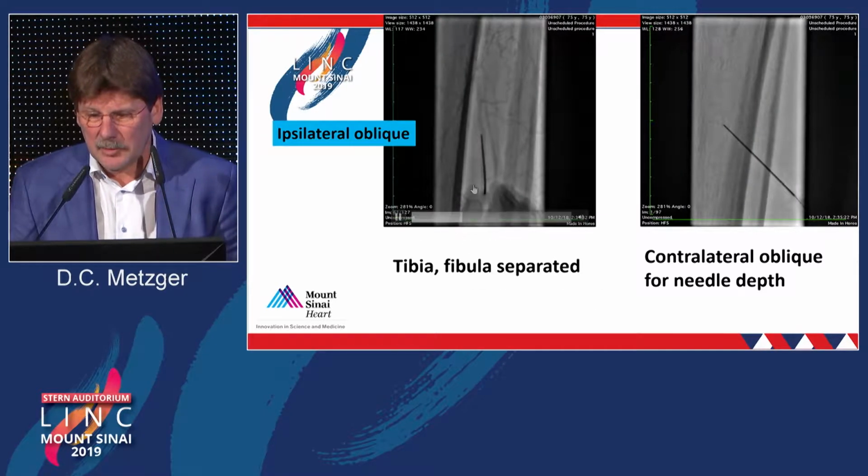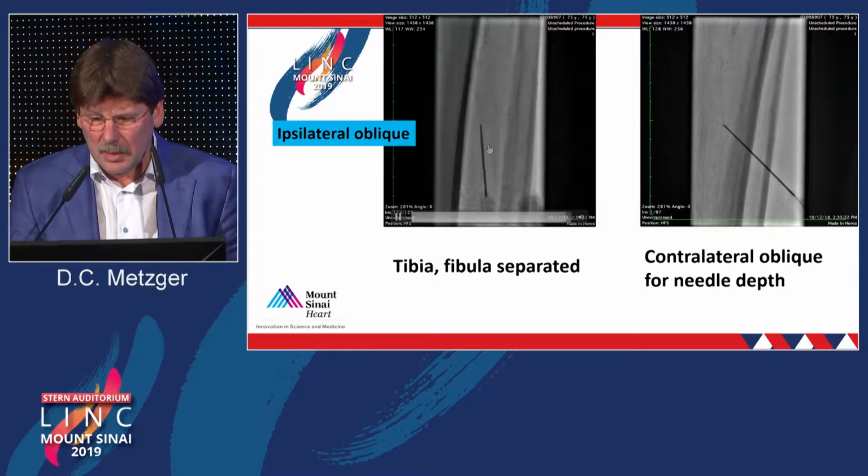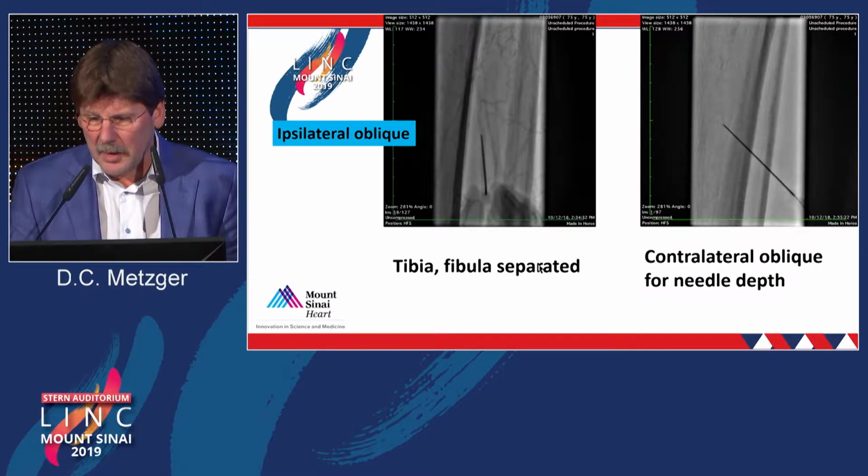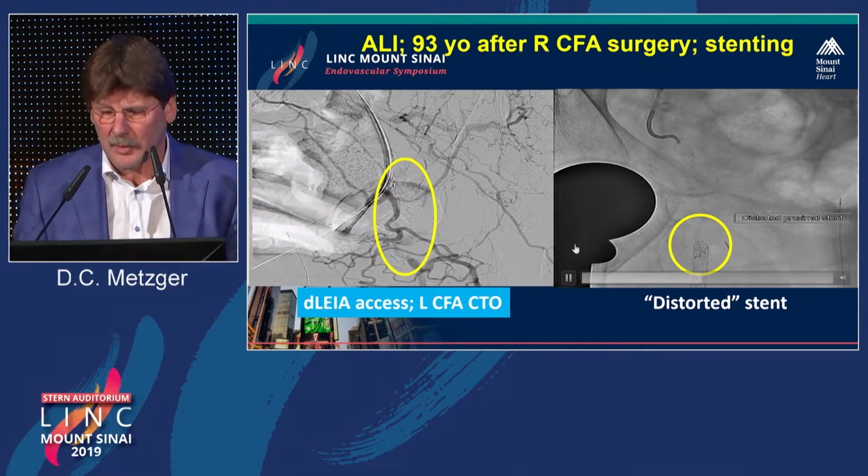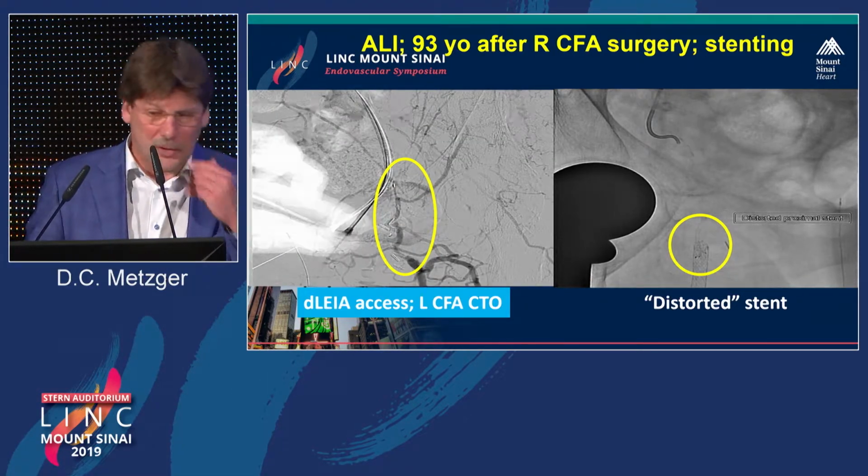Here's a dynamic angiogram. You can see, again, notice how we separated the bones out. That's the view you want. And then here's the other view, the contralateral, for depth. I want to show you a few cases where it's really helpful.